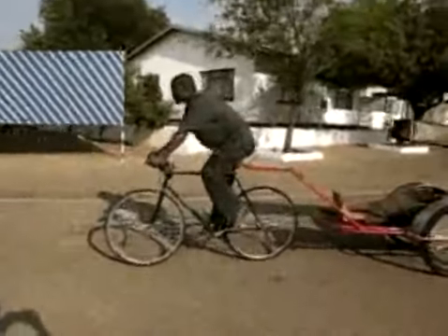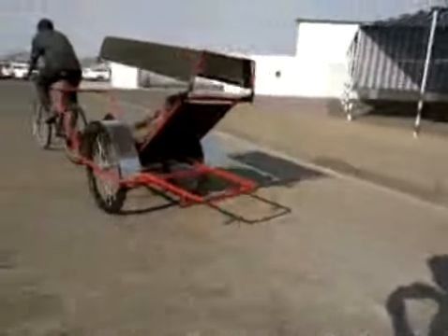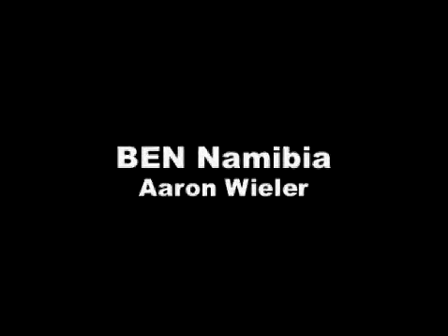Test ride each ambulance, first without a passenger and then with a passenger, to ensure proper functionality and safety.